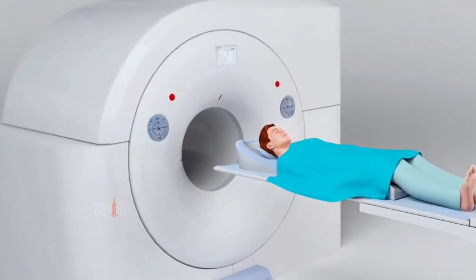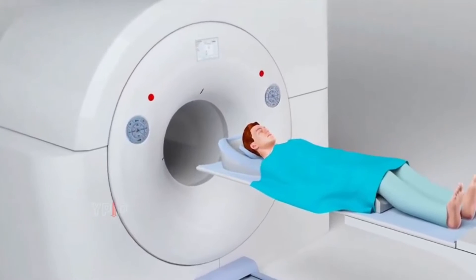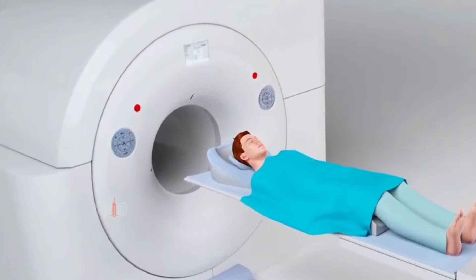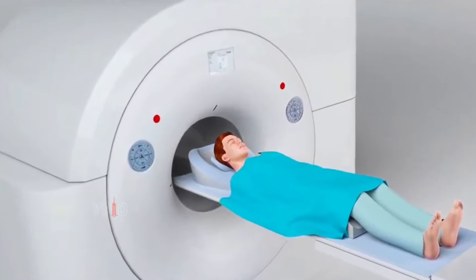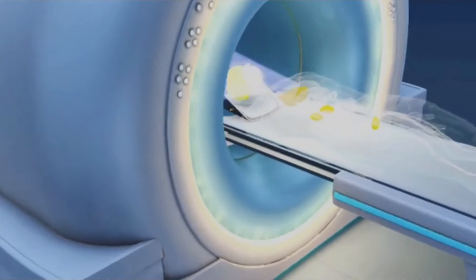Hi, welcome to another video of Biomedical Engineers TV. In this video, we will look into computer tomography machines, which is also known as a CT scanner. Let's look at where it all began.